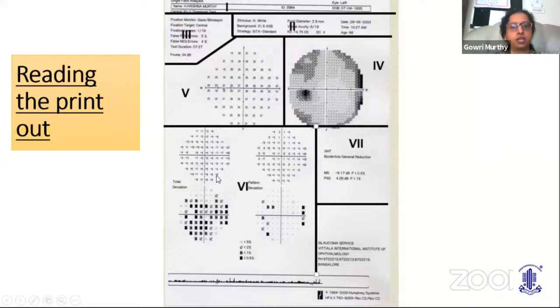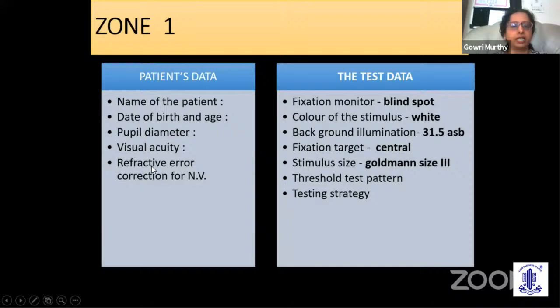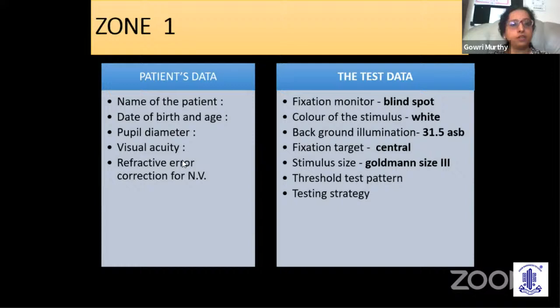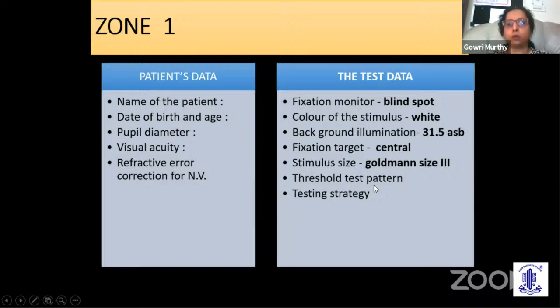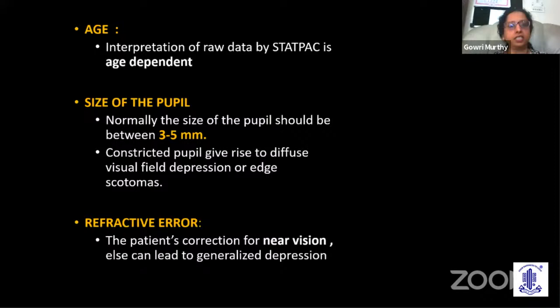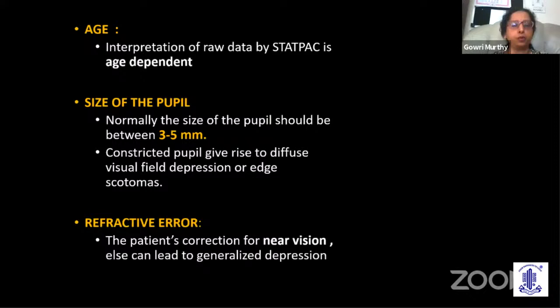It helps to have a region-based approach to reading a printout. The first zone has patient data: name, date of birth, pupil diameter, visual acuity, and refractive error should all be entered. Encourage your perimetrists to enter everything — even visual acuity should not be left unentered. The test data tells you what test and strategy is used, the stimulus size, and other factors such as the fixation monitor. Age is important because STATPAC interpretation is age-dependent. A constricted or dilated pupil can give rise to visual field effects which could be confused; refractive error should be corrected for near vision, else it can lead to generalized depression.